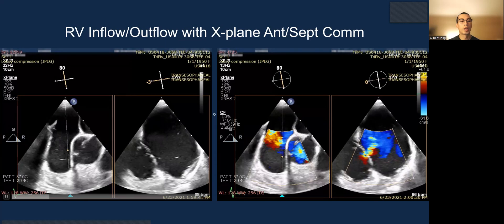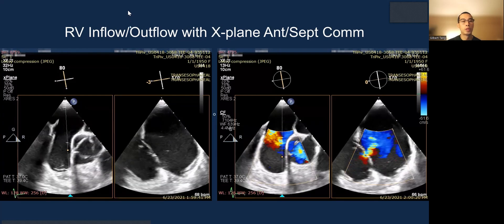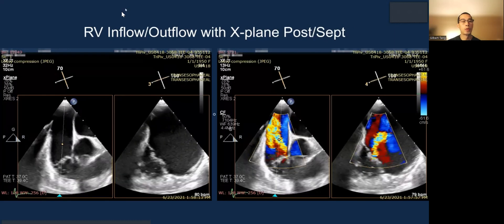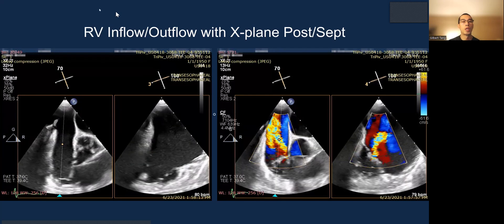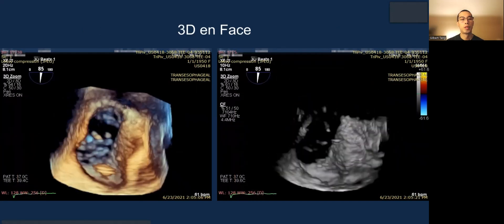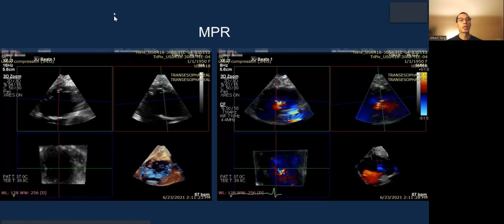The key view is the inflow X-plane sweeping from anterior septal by the commissure, to the middle of the valve, to central, and finally to posterior septal. This allows you to understand the jet location, the coaptation reserve, and the clipping strategy. 3D en-face is relatively useful if you can get good images.